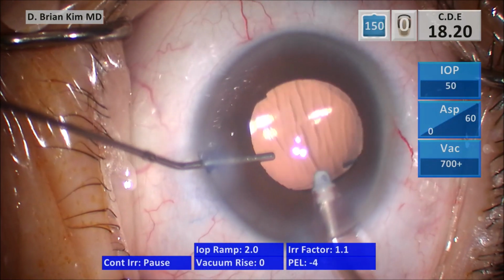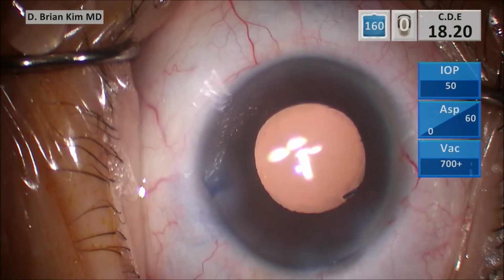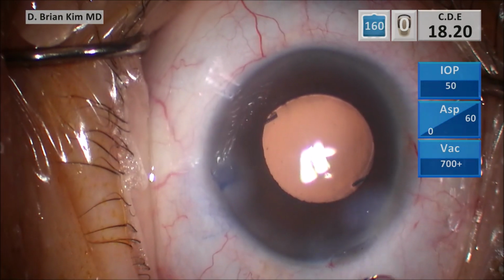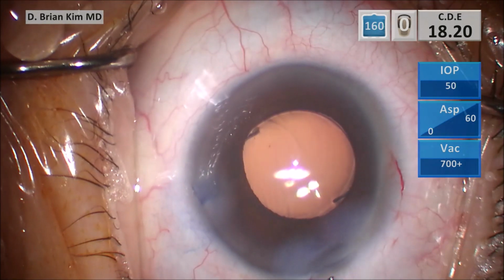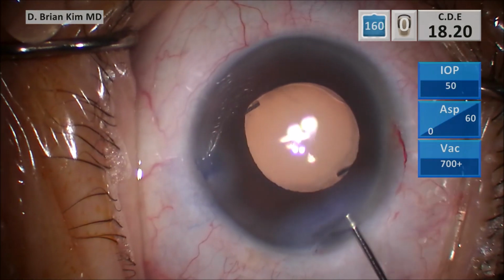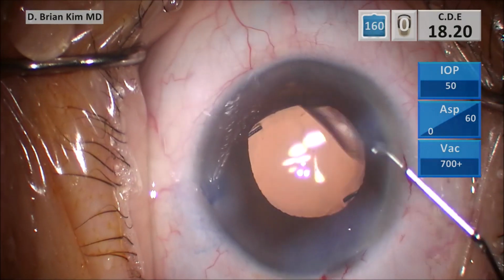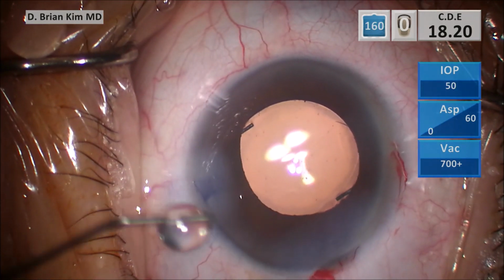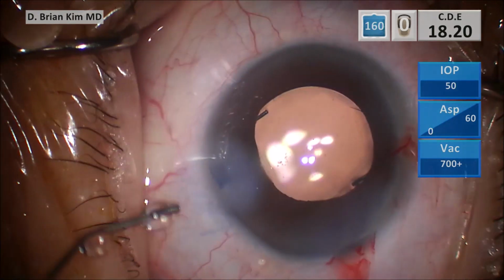Remember, we are the defenders of the corneal endothelium. When we do cataract surgery, we should not be the attackers of the corneal endothelium, right? We're not supposed to be attacking the corneal endothelium by damaging it with our phaco. We should be the defenders of the corneal endothelium, and we should be coating it with dispersive viscoelastic. But not only that, we shouldn't be doing techniques that cause the viscoelastic to come out. Don't use high vacuum near the cornea. That will cause the viscoelastic to come out, and now you're not a defender of the cornea, you're the attacker of the cornea. You're damaging the corneal endothelium with the phaco energy.